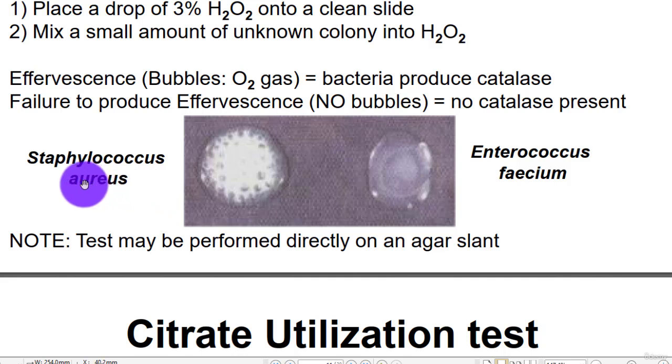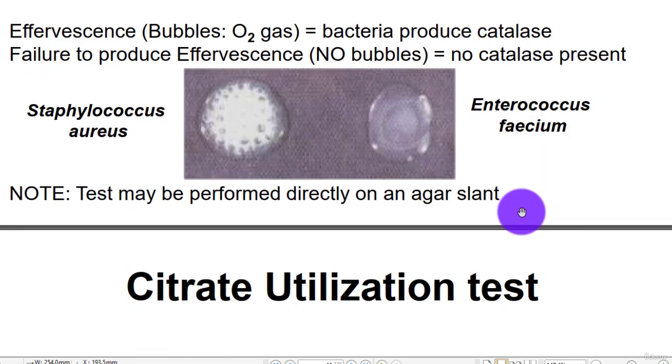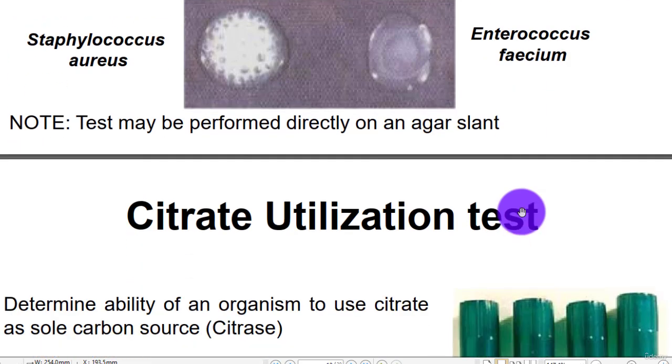Staphylococcus aureus, Enterococcus faecium. The test may be performed directly on an agar slant.